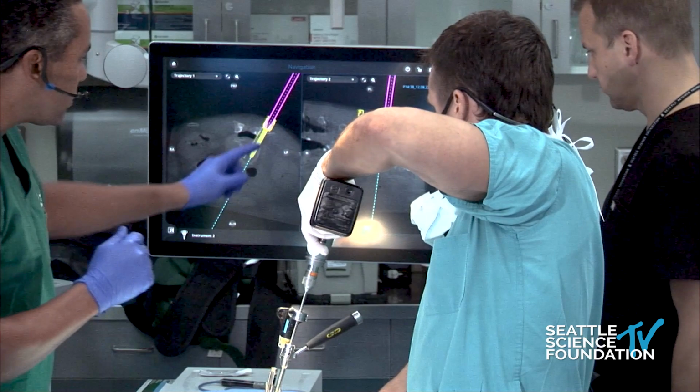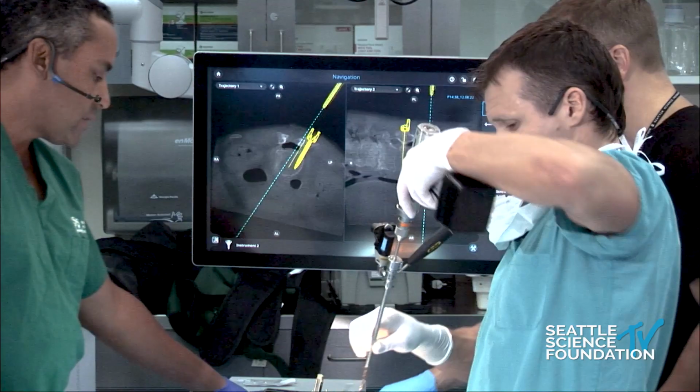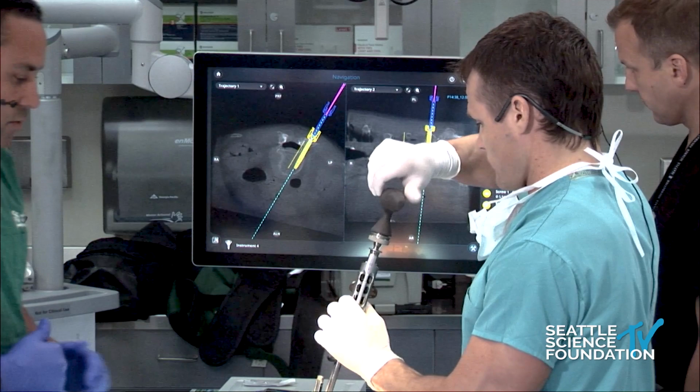So just do a little bit of hand towards head. Yep. And a little bit more medial. There you go. Go for it. Okay. Stop. Drop it. He's going to drop that screw. You're going to come out. He's got your screw loaded up for you. He's going to make it blue. You're going to make blue match yellow. Matches. Okay. And then you're going to put your screw in.